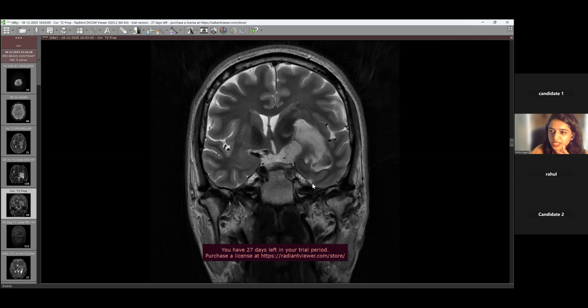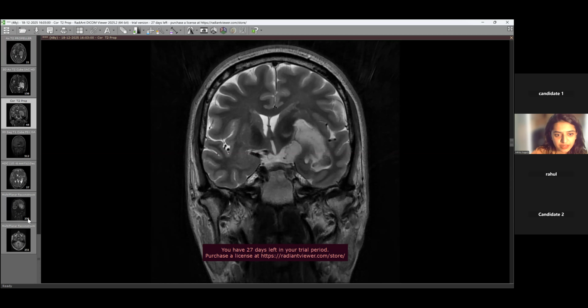And for most of the patients, you can look for any prior images for comparison, those two things. But yeah, very small things only. Apart from that, I think I'll have to share my screen again to go to the other cases. So I'll just tell you.